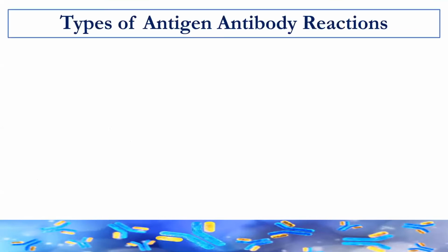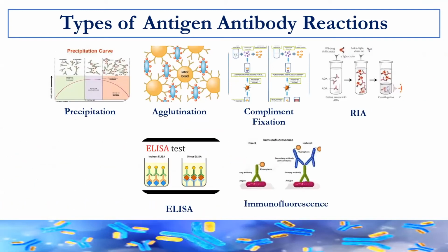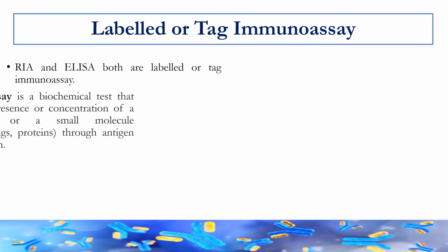So now, in this lecture, we are going to concentrate more on radioimmunoassay. Both these techniques, radioimmunoassay and ELISA, are nothing but labeled or tagged immunoassays. Now what do we mean by labeled or tagged immunoassay?